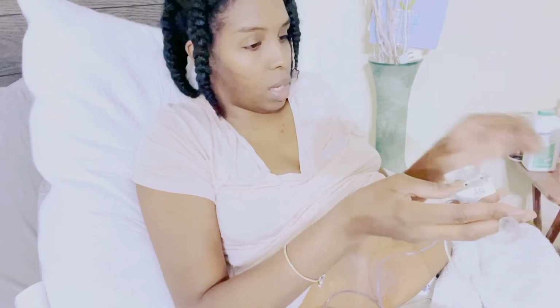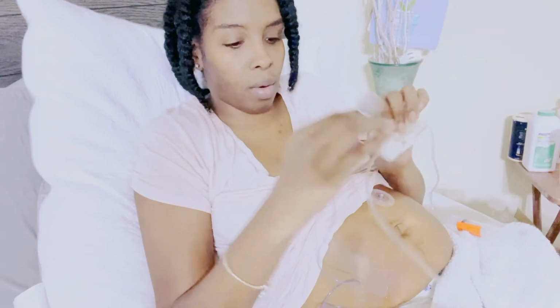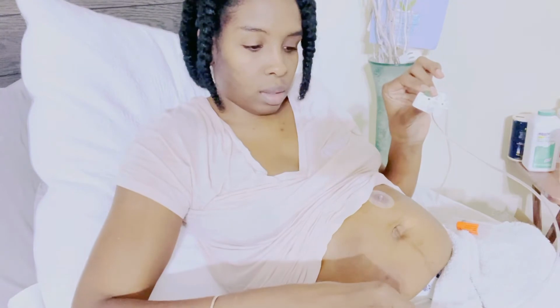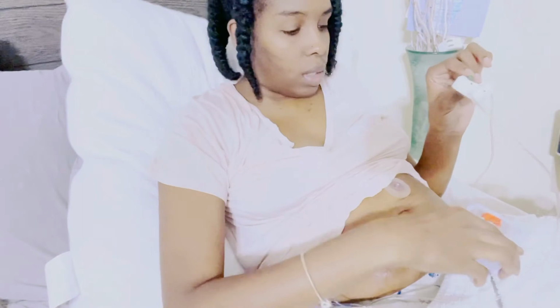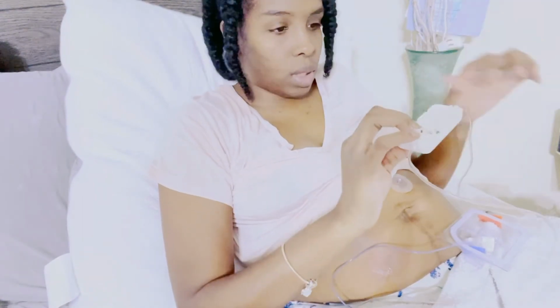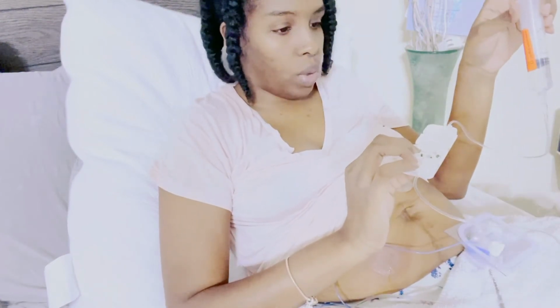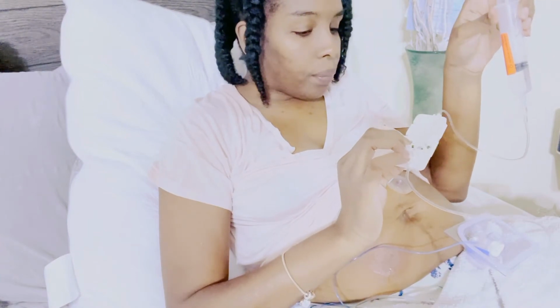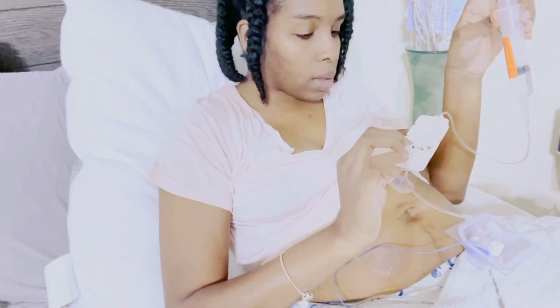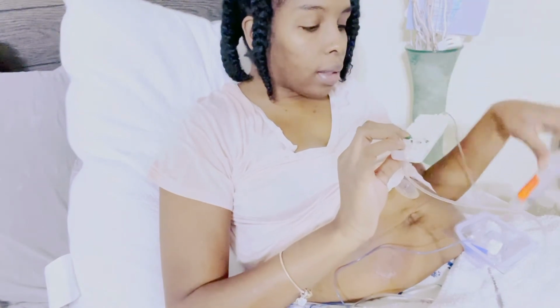Okay, so now that releases this bottom piece here. So now you see this green tab here, you're going to pull that down. So I'm gonna put this into the little container I have. See this here. All right, so I press this down to open up the tubing to allow this medicine to go through. So I'm just gonna push a little bit of the medicine through, till it gets to the tip there. I can see it. All right, it's there.